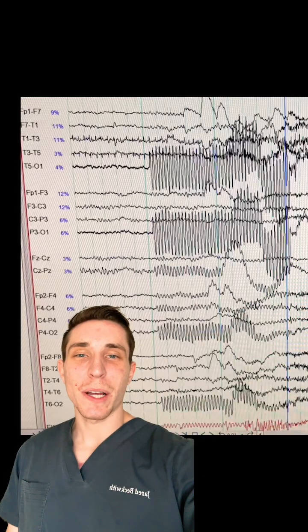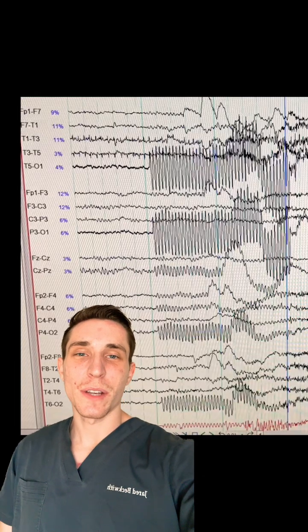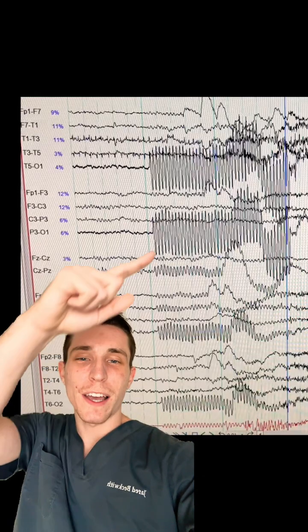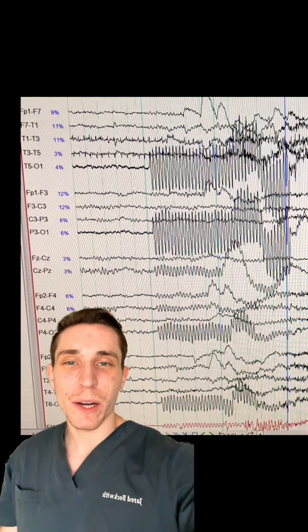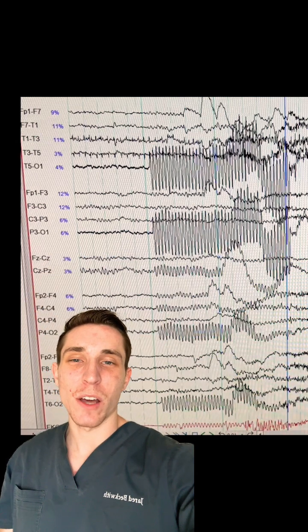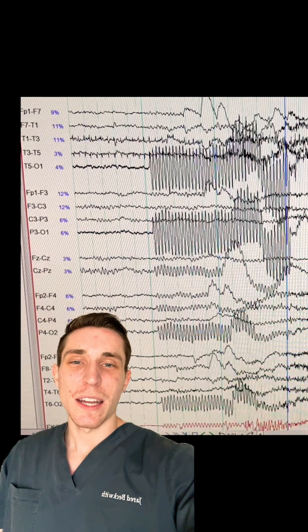Hey everyone, Jared Beckwith here. Today's video I wanted to show you guys this cool find I found while doing EEG brainwave monitoring on one of my patients at the hospital.